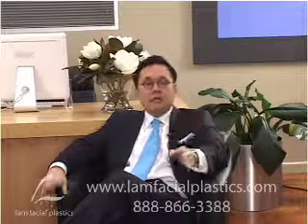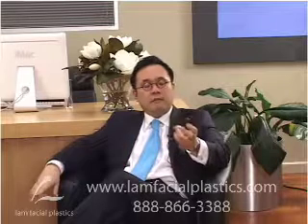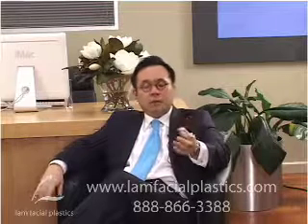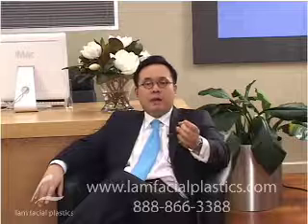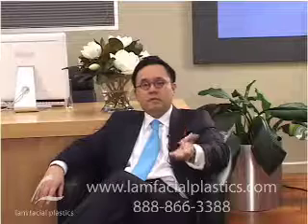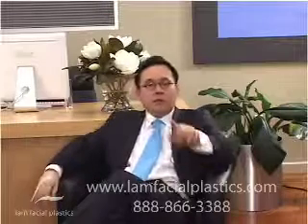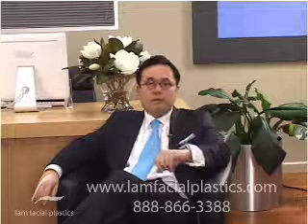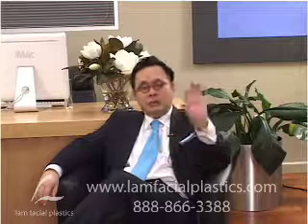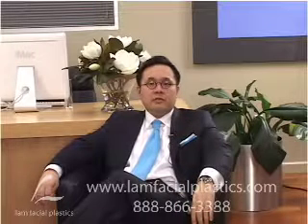And so that's just a short synopsis of why I don't prefer solid implants. They shrink, they get infected, they feel hard, they don't look natural, and they don't feel natural. And I challenge you to make a big distinction between what a physician hands you in their palm to what you feel in a person's lip. Go feel someone's lip that's had it done, and I defy you, squeeze it between the fingers, touch it, and ask that person, are you constantly reminded you have a solid implant in there? And most people would say they regret it.